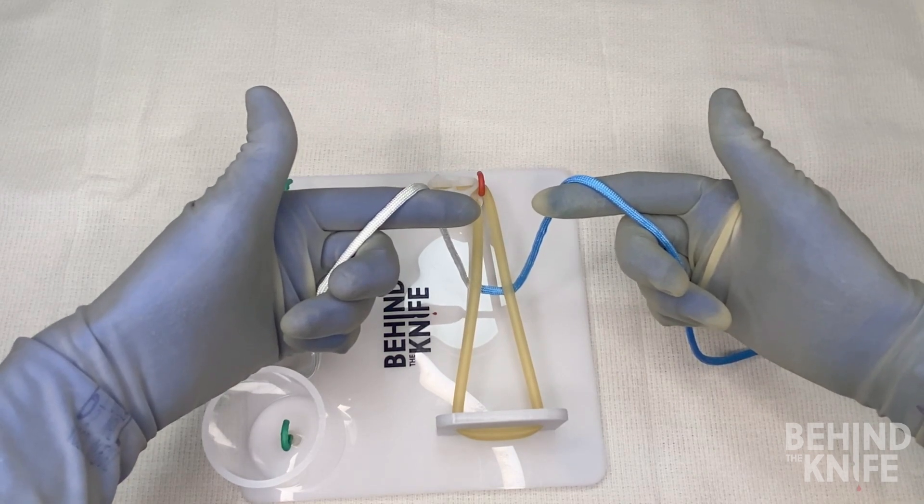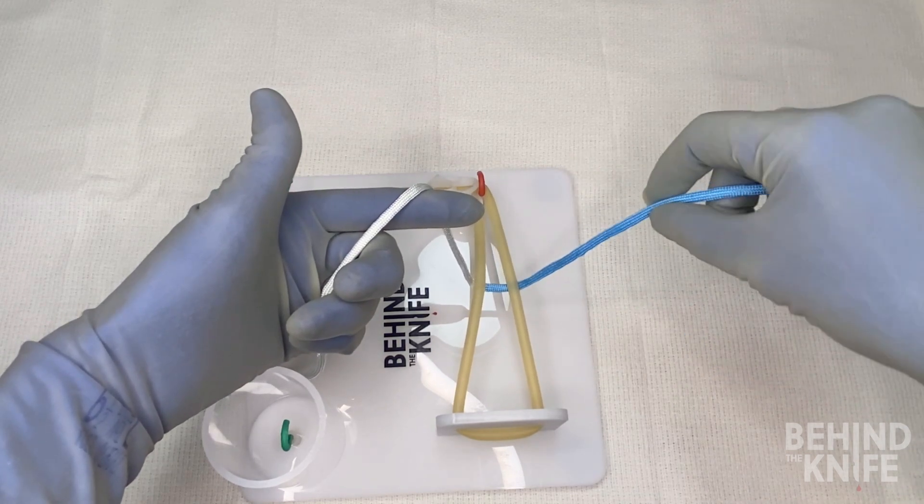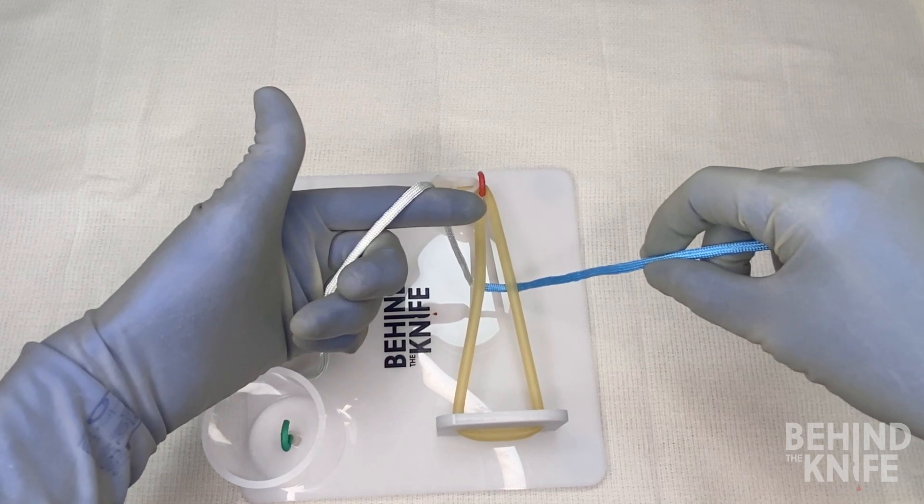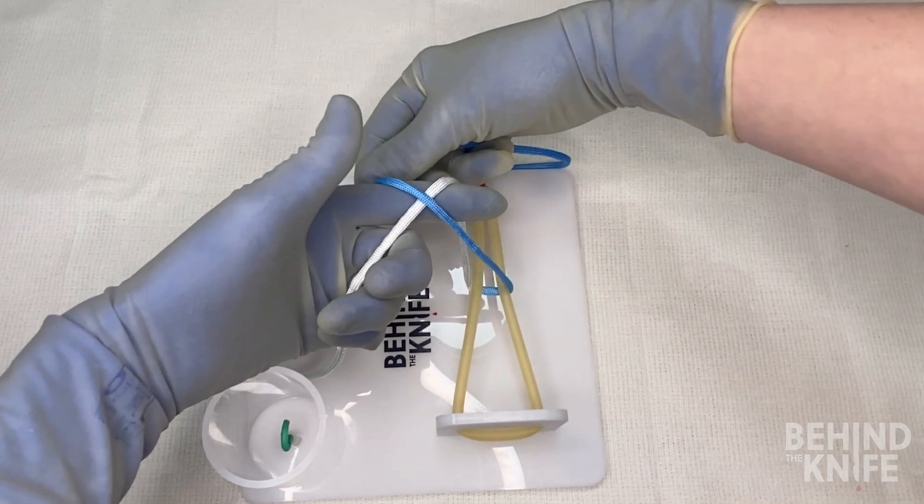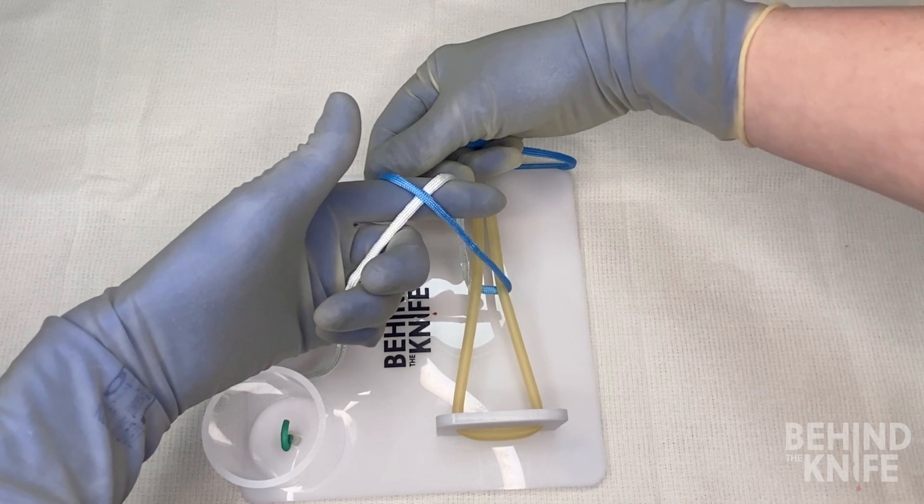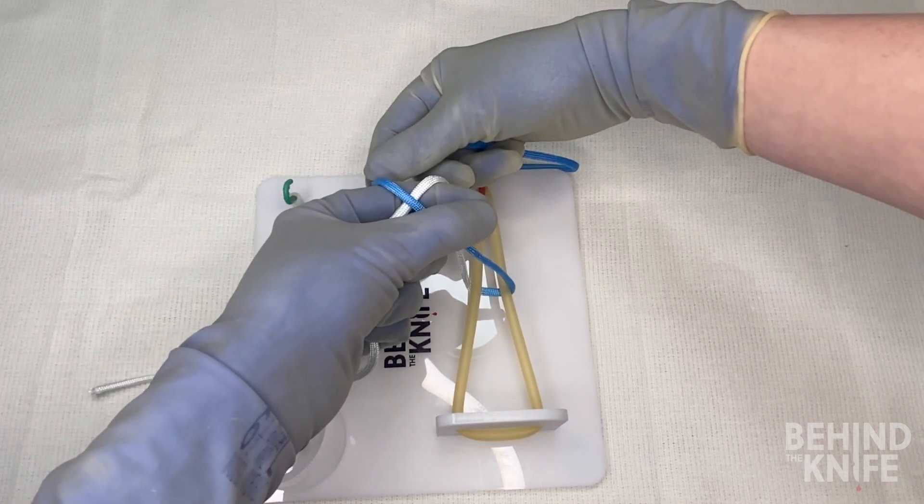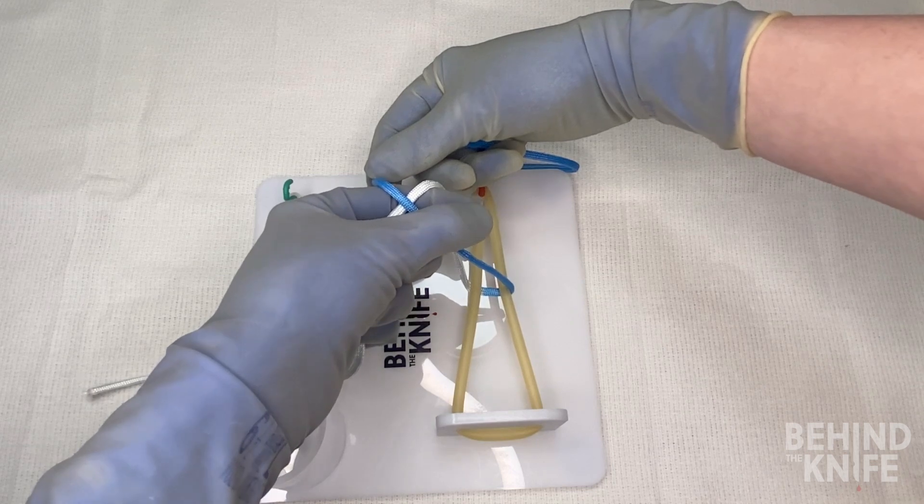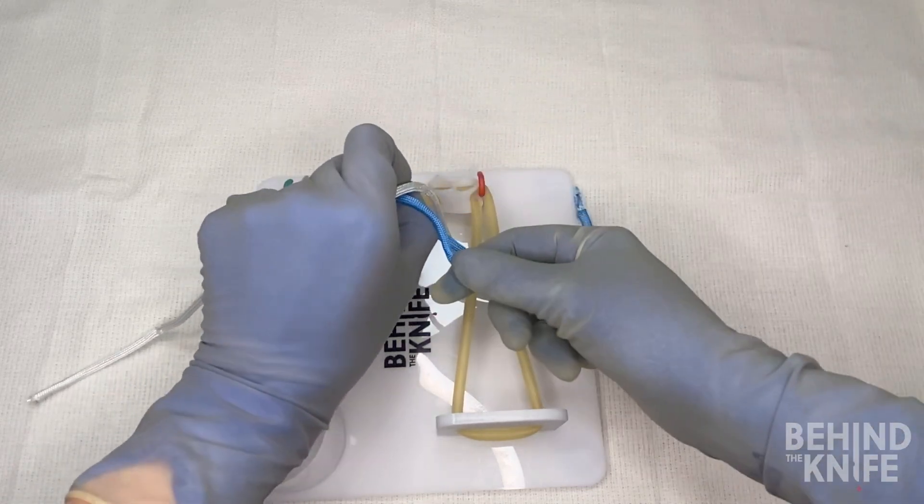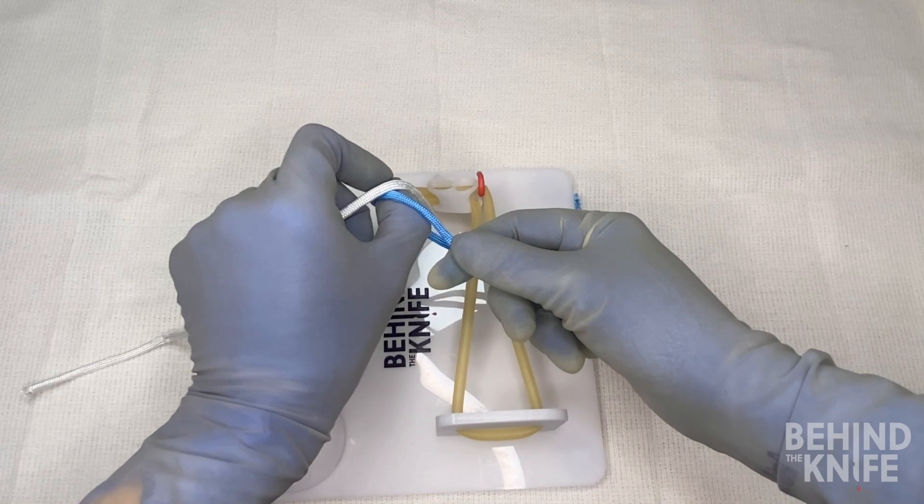So to start, what we'll do is we'll take the blue end of the string that's in our right hand, and we'll cross it over our left index finger to make an X. From here, we're going to pinch our thumb and our index finger together, and what we'll do is we'll rotate our hands, so now our thumb is on the bottom and our index finger is on the top.